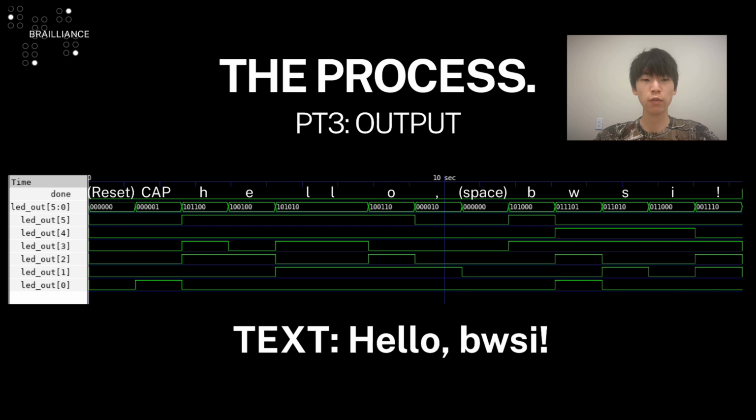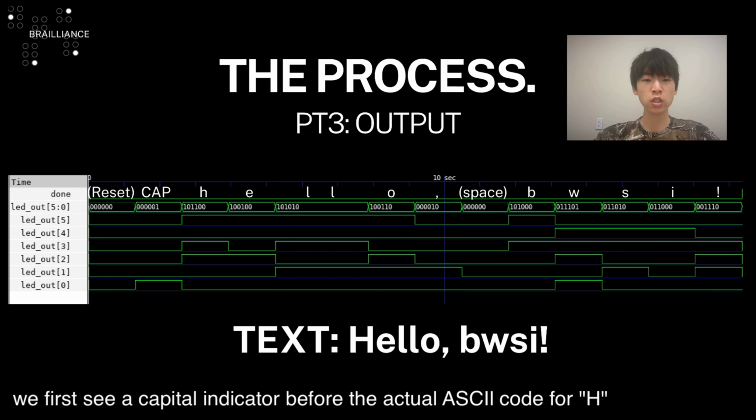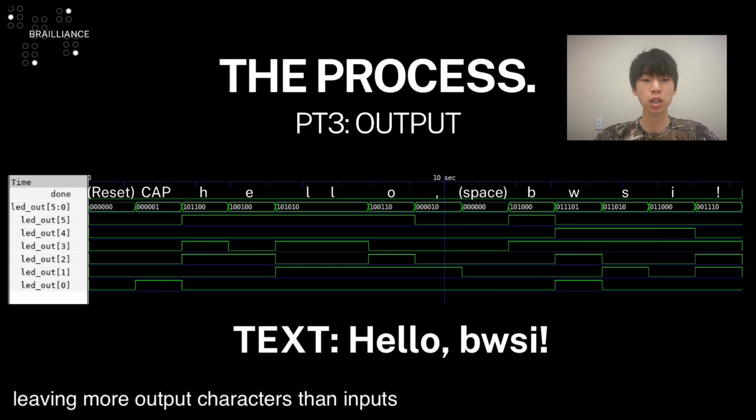Here is the output provided from the provided input. Each character is displayed for roughly 1.3 seconds and can be read as Hello BWSI. Notice that to represent the capital H, we first see the capital indicator before the actual Braille code for H, leaving more output characters than inputs. This will be seen in the following demonstration.